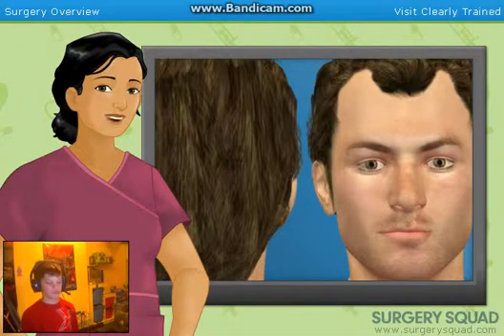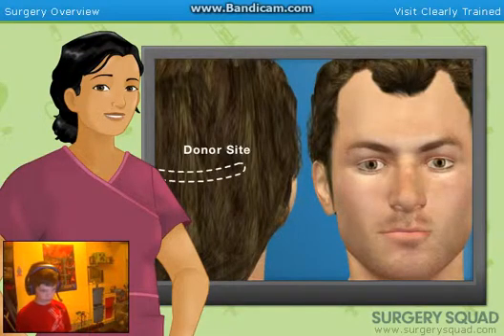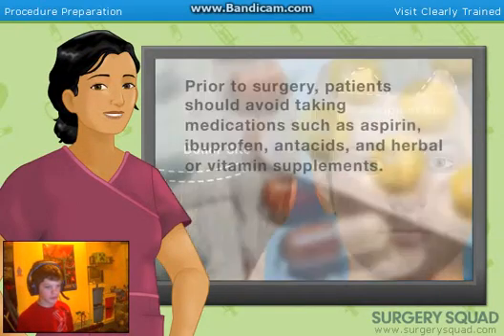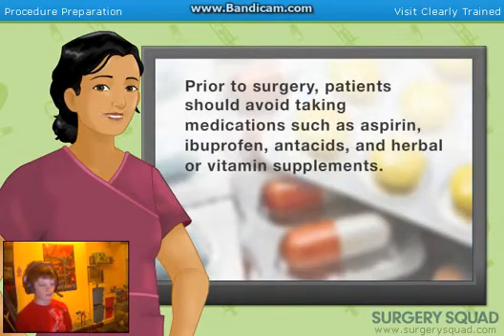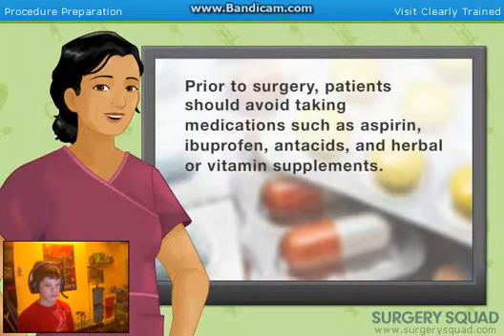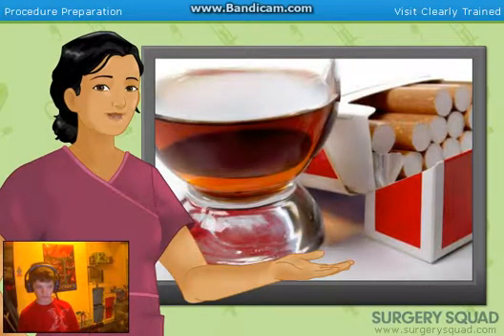Strip harvesting involves removing a small strip of scalp from the donor site under local anesthesia and transplanting the pieces or grafts of the scalp into the recipient site of the patient's head. Before the surgery, our patient was advised by his doctor to avoid using any medications that may result in a poor take of the grafts. These medications include, but are not limited to, aspirin, ibuprofen, and antacids. Alcohol use and smoking before and after the surgery can also result in poor graft survival.